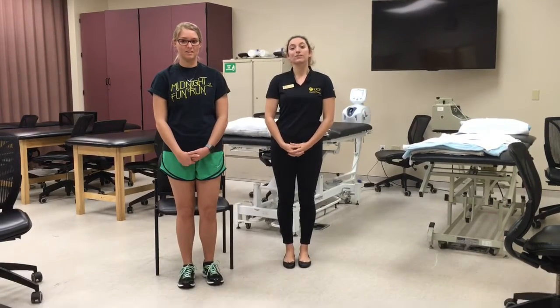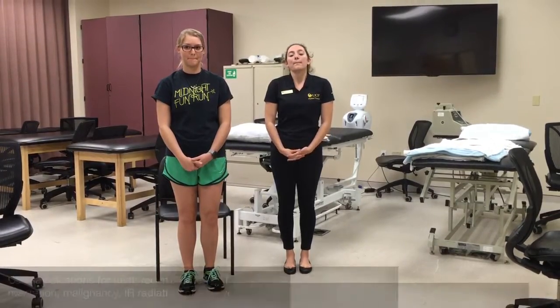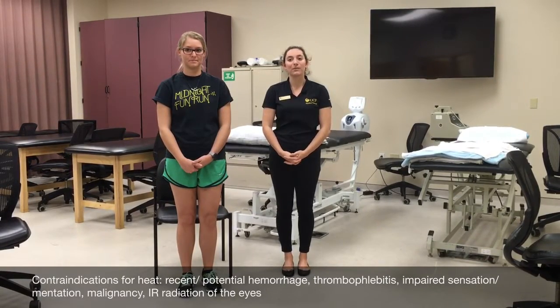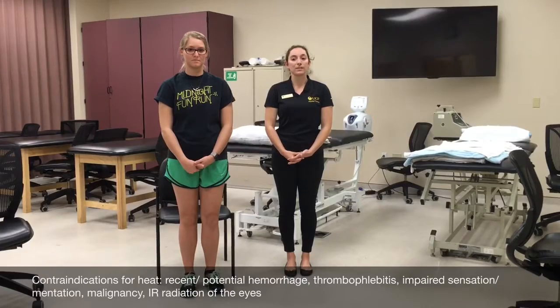First, I'm going to establish the appropriateness of thermotherapy by assessing for relevant contraindications and precautions. Based on her evaluation, a main contraindication is the patient's impaired sensation in her feet, which is why I'm going to apply the heat pack more proximally to increase circulation to her distal lower extremity without excessive risk.